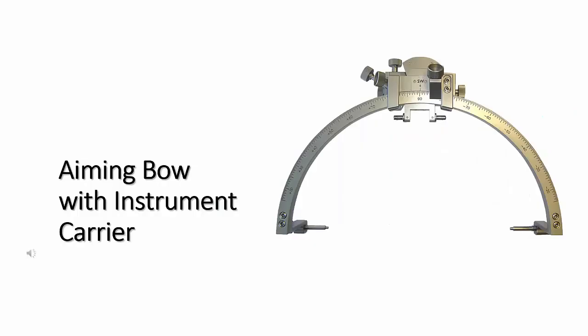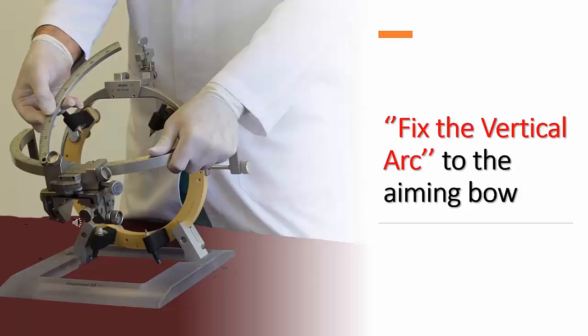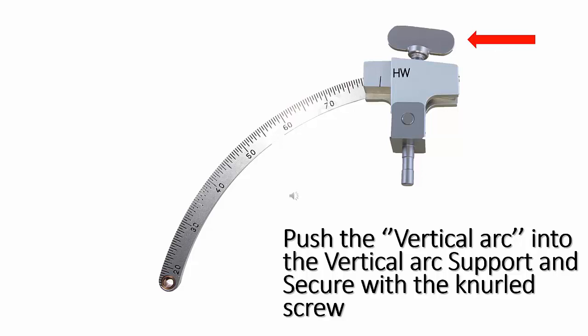The aiming bow unit of the RM covers all individual parts required for fixing the aiming bow to the headring. Insert the aiming bow with the instrument carrier mounted so that the two threaded points on the left and right fit into the receptacles on the stereotactic headring. There are various sizes of vertical arcs that can be used depending on the vertical angle required. There are two metal pins at 90 degrees on the inner side of the aiming bow for hooking on the vertical arc. Whether the vertical arc is fixed to the right or left pin will depend on which hemisphere the target point is located.